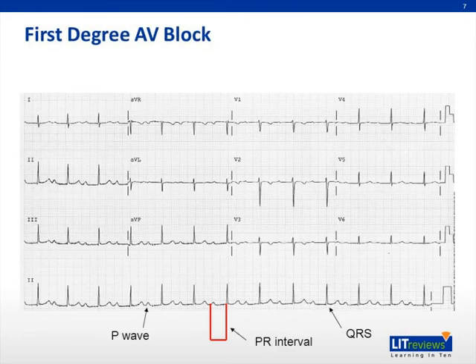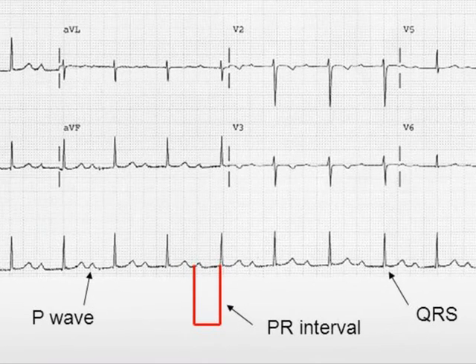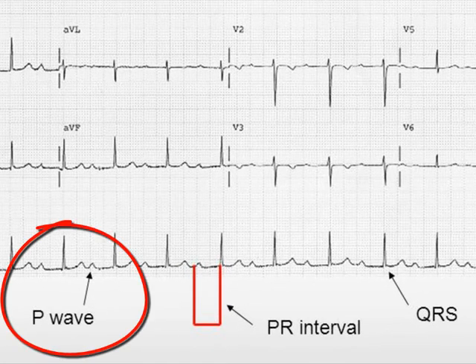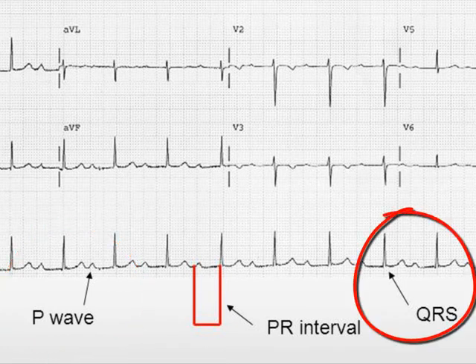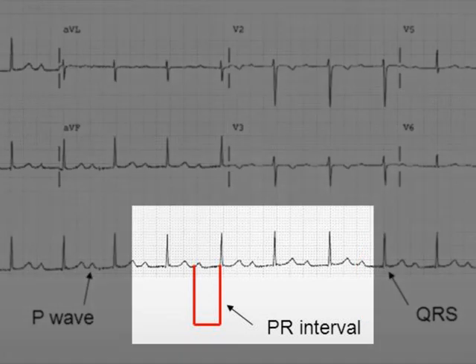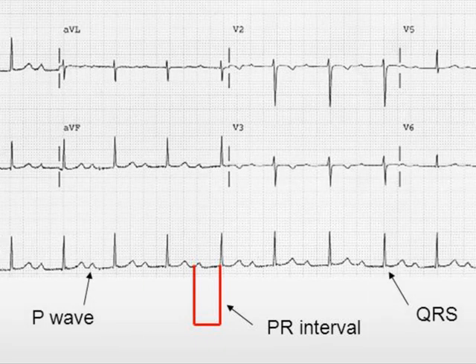This is a 12-lead electrocardiogram of a patient with first-degree atrioventricular block. Direct your vision to the P waves and QRS complexes labeled at the bottom of the slide. The red lines define the PR interval, which is measured from the beginning of the P wave to the beginning of the QRS complex. This patient's PR interval measures 330 milliseconds, meeting criteria for first-degree AV block regardless of age.